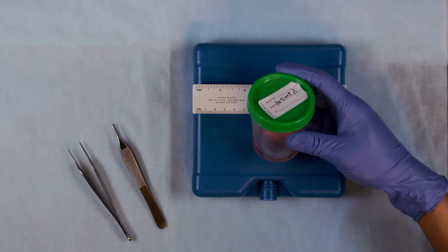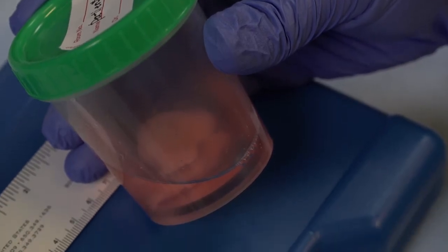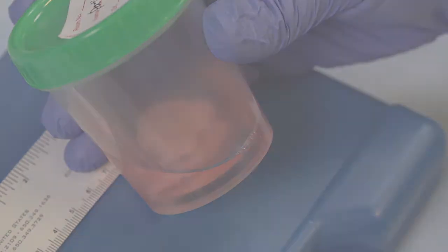Immediately, antral follicles need to be aspirated with an 18-gauge needle and scanned for immature oocytes. Ovaries are then transferred to cold media on an ice surface for dissection.